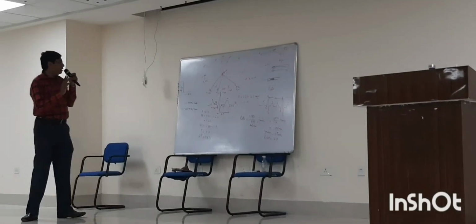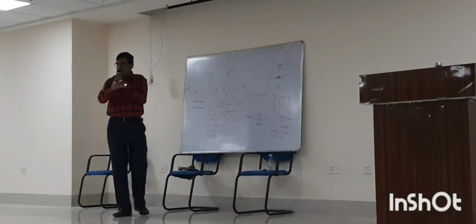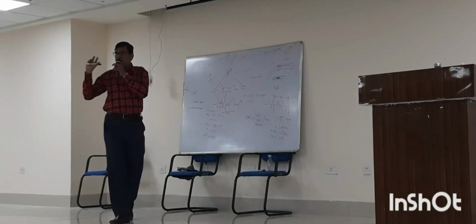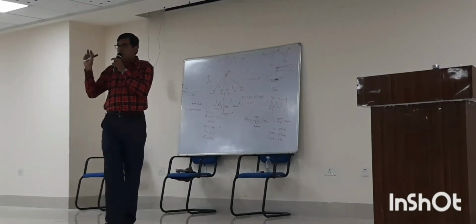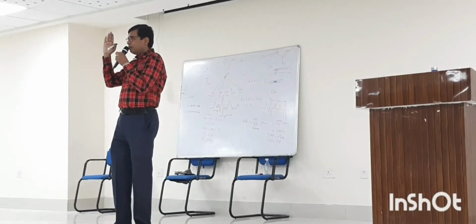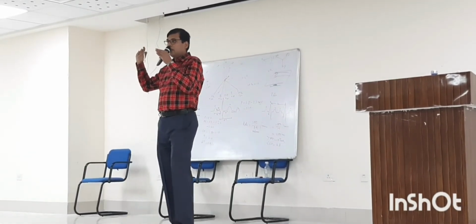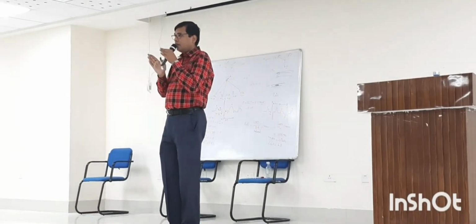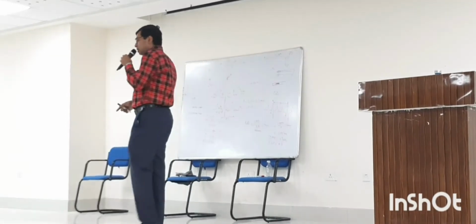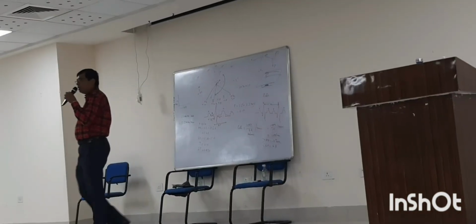Ideally, it should be plotted over the hexaxial reference system. The QRS difference you have to plot over the respective arm. Then you have to draw a perpendicular. The two perpendiculars intersect; connect that point to the center. And this is the electrical axis. Now come to the individual waves.